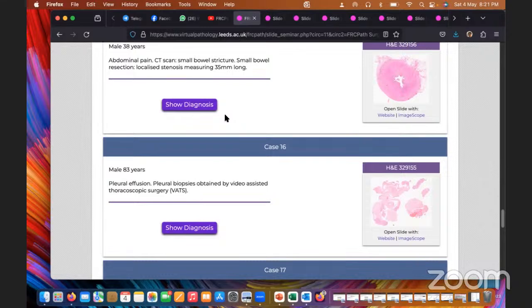Can we have a differential of polyangiitis with granulomatosis in the last case? Dr. Akhtar, I think you are considering the lung case. Yes, you can put a differential, but you must show that there are more eosinophils in number, and more vasculitis apart from one or two.